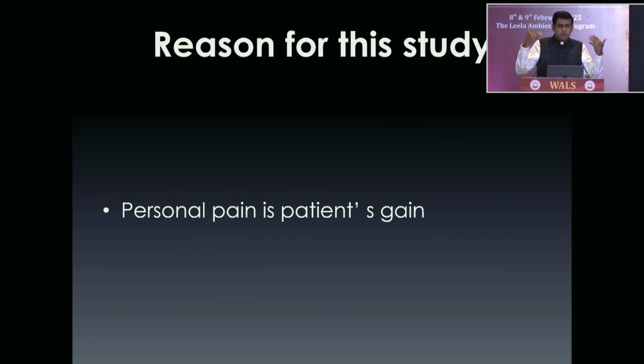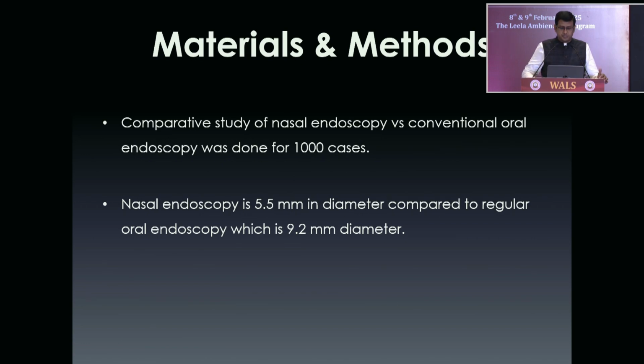Then that was on the back of my mind, and when I was in medical college, fortunately, I had a pediatric endoscope. I did it for an MBBS student. She was just closing her eyes, and after I finished my nasal intubation and came out, she said, "Doc, is the procedure over?" That was the spark, and I thought, let me further dig into this procedure and make it a standardized procedure.